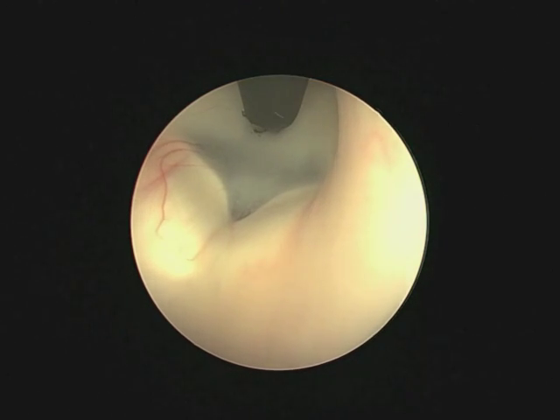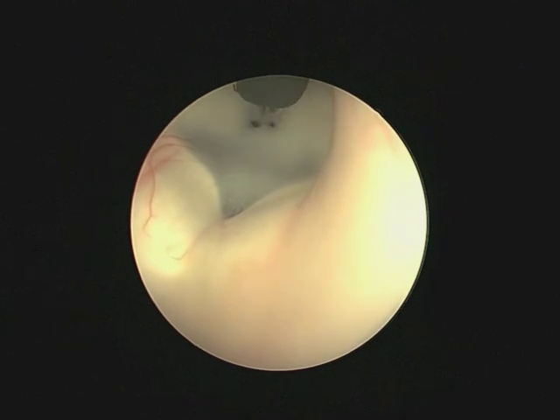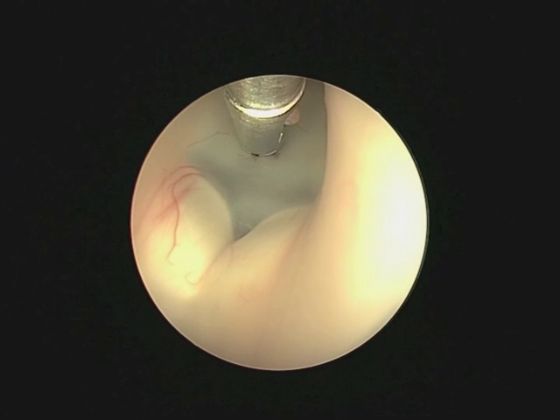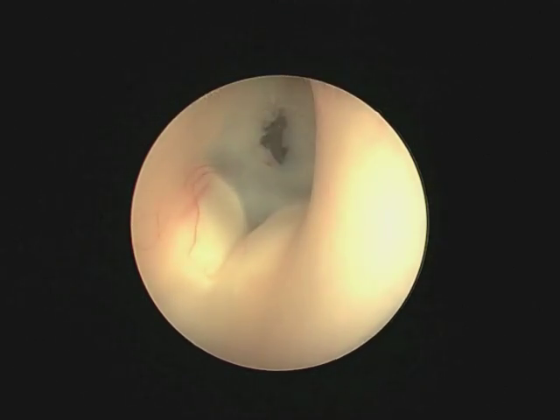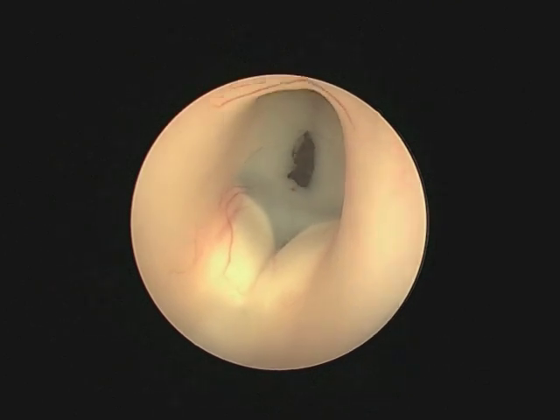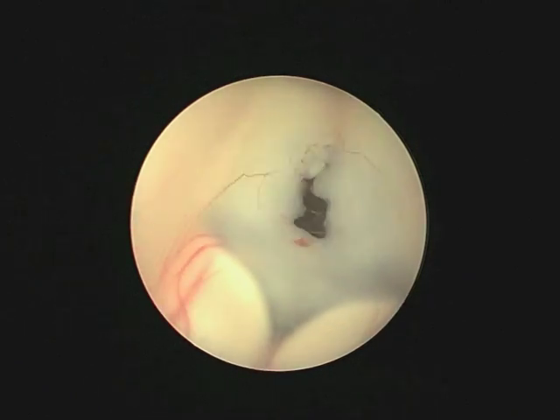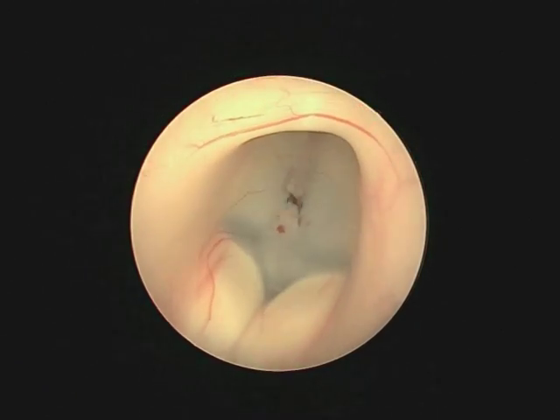A bipolar was utilized to coagulate the floor of the third ventricle in front of the mammillary bodies and behind the tuber cinereum. An alligator forceps was used to enlarge the size of the opening, and flow was obtained between the interpeduncular fossa and the third ventricle.